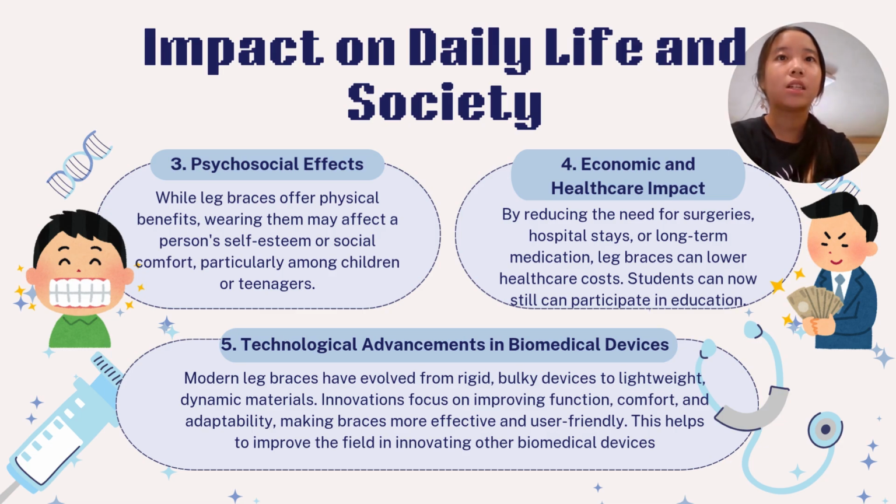The last is the technological advancement in biomedical devices. Modern leg braces have paved the way into improving the biomedical field. It has evolved from rigid, bulky devices to lightweight, dynamic materials. Innovations focus on improving function, comfort, and adaptability, making leg braces more effective and user friendly. This has helped improve the field in innovating other biomedical devices.